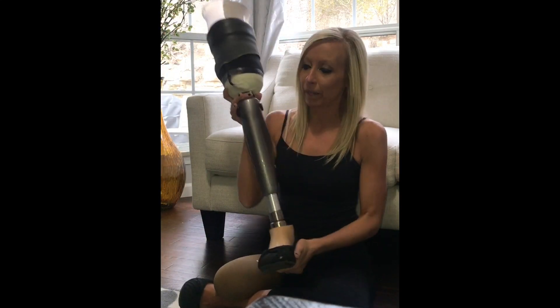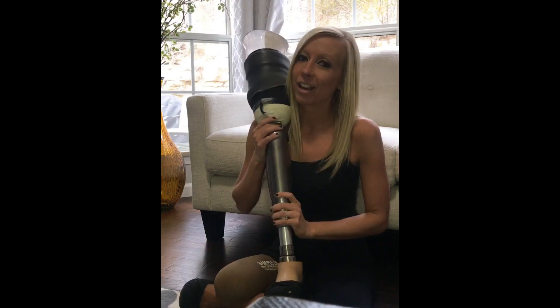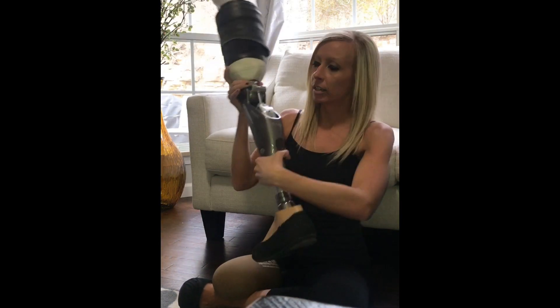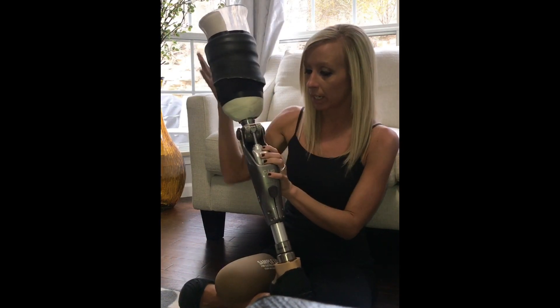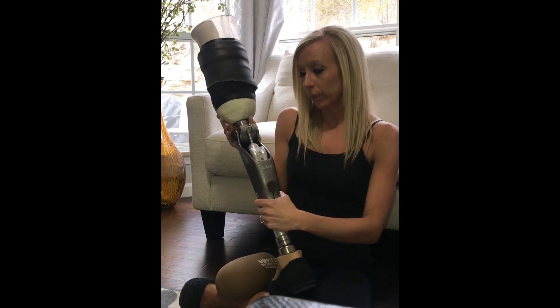I've had a lot of questions about my robot leg or my microprocessor knee, so I figured I'd show you how it works and a couple cool things about it. Basically, here's the back of it — it's got all this technology, a hydraulic system, and kind of like a computer chip, so it's really smart.